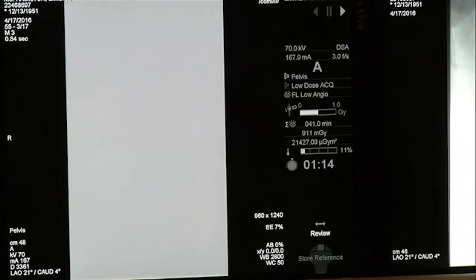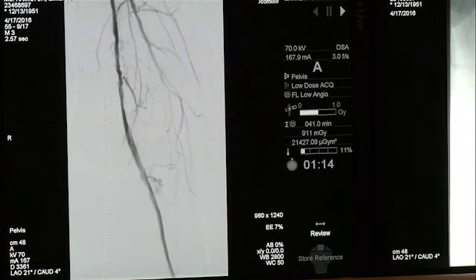What do you think we should treat the SFA with? So we have that, this area is very protected. So I'm thinking, the options are, I don't think we're going to get away with DCB. What do you think? My personal vote is to stent this, and my personal vote is to put more Viobonds.